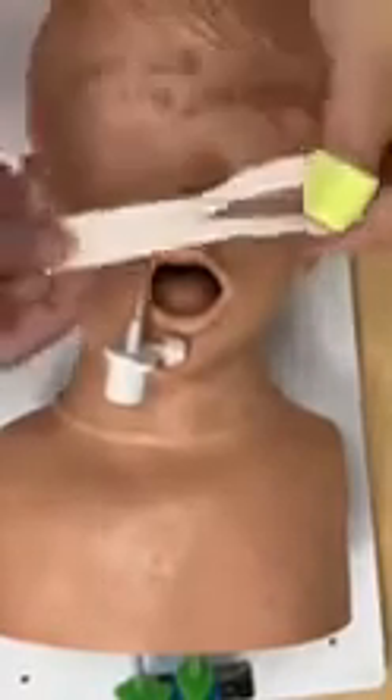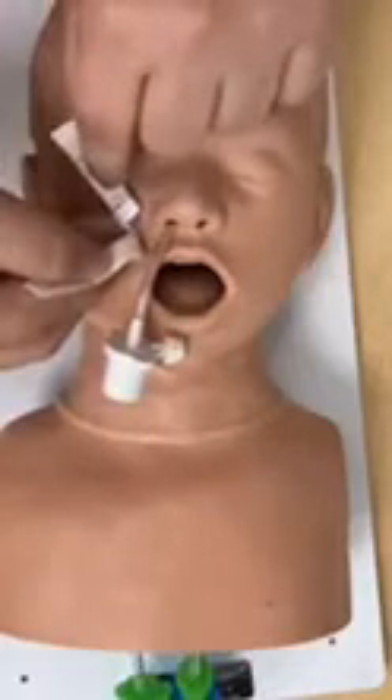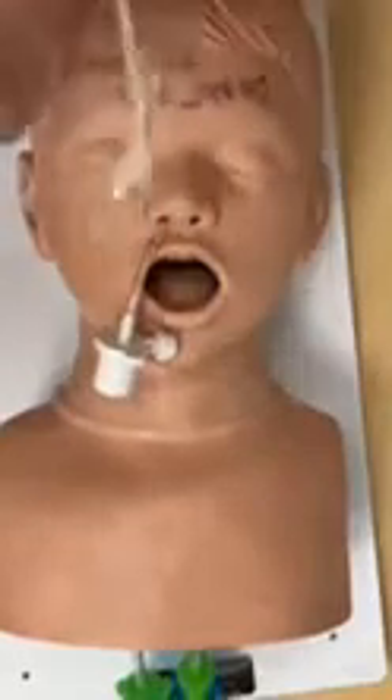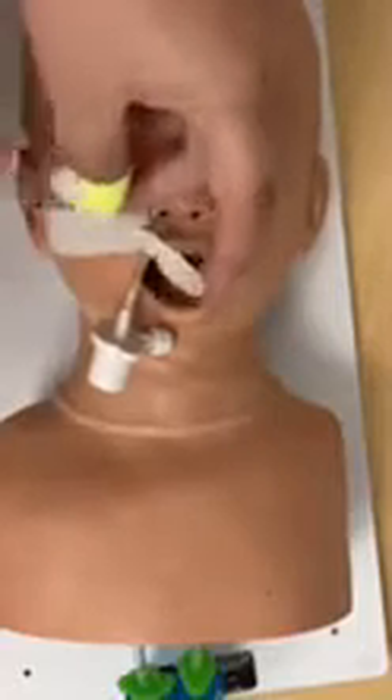To start off, you cut your tape the same way that you would if you were taping an oral tube — with the two legs and the solid piece. You're going to want to line up where the edge of your cut is to the nare, then go back a little bit. You want to get as close as you can to the nare, but you also want to leave room to cross the top piece over at the end. Line it up and pull this piece back to get it out of the way.